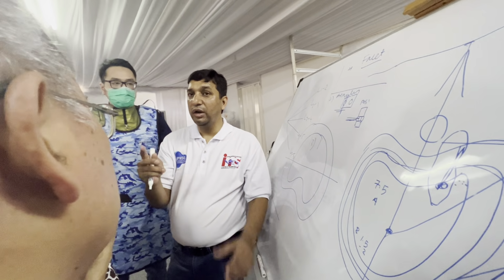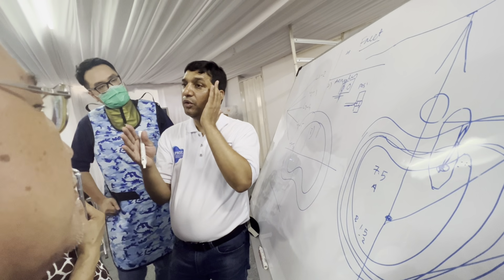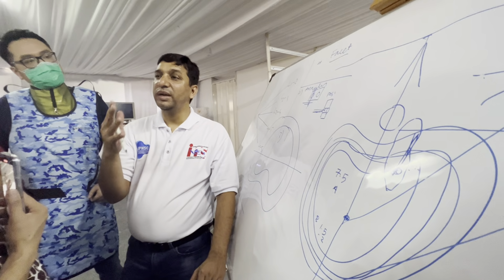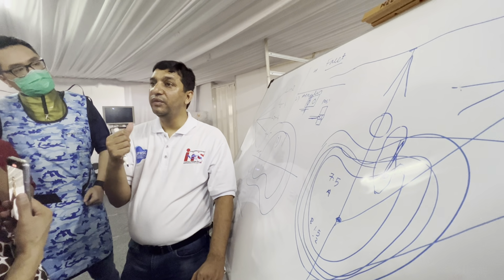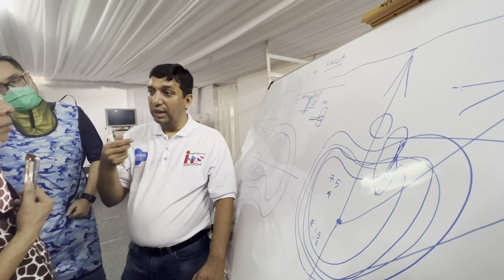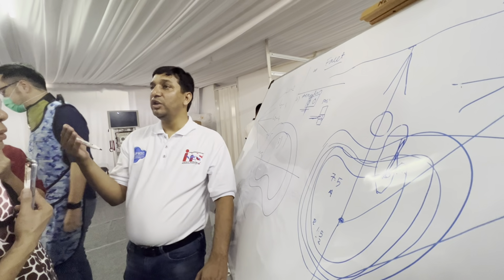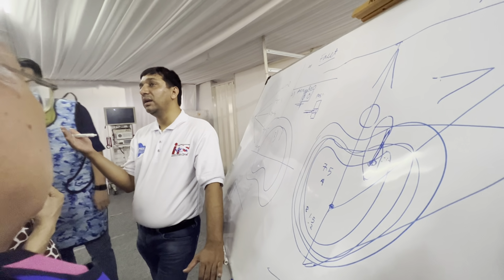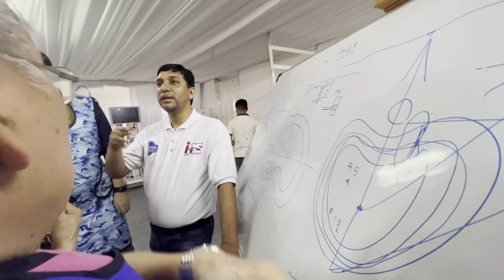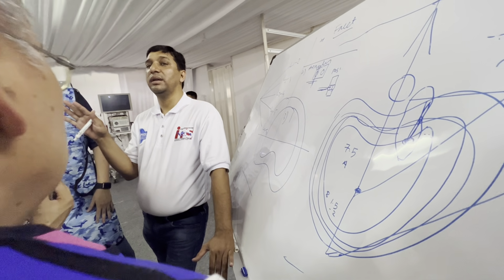Once you do a good annulotomy, it will give you the way and it will make the herniation more free. And then you put your grasper. A small grasper is better because you do everything under visualization. Some little angled graspers are better because they will align with the axis of the endoscope. Whatever you are seeing is at a 30-degree angle. So what you see, grab it and just come out. This will make your life very easy.